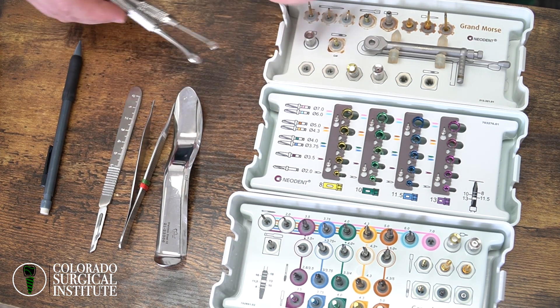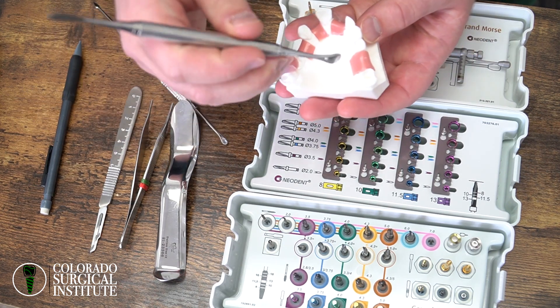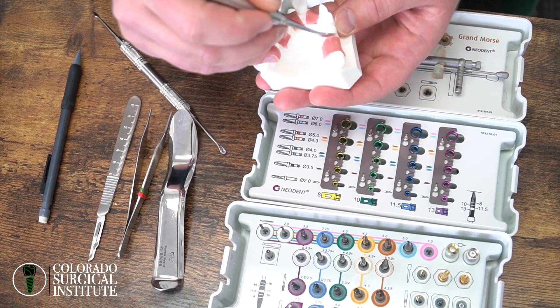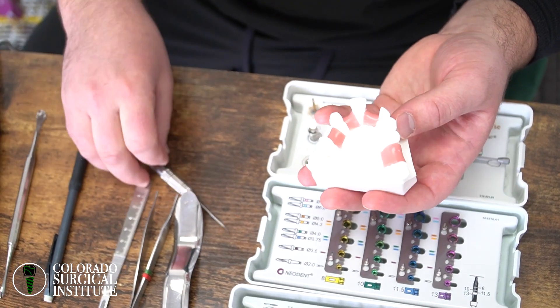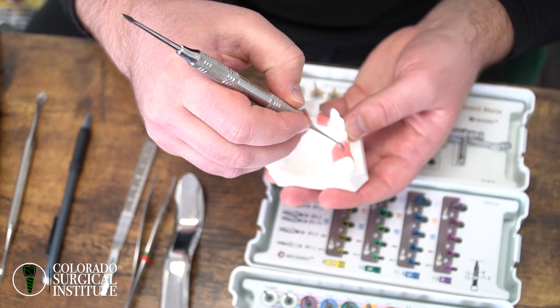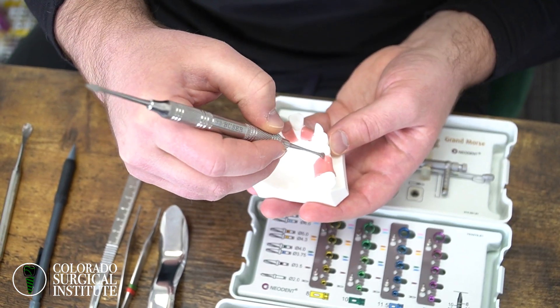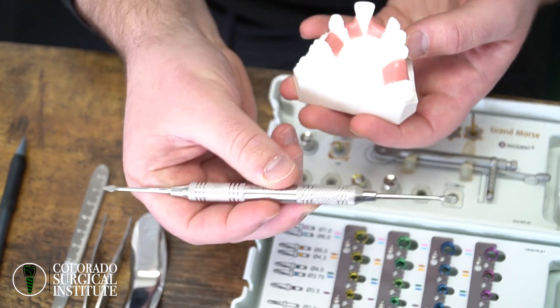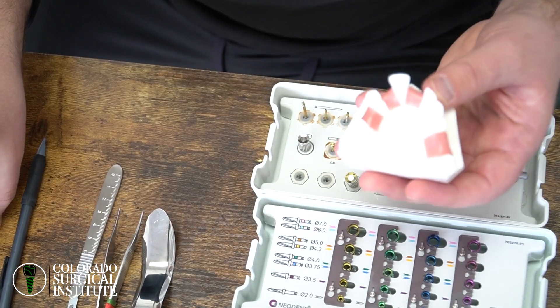If you go in with the larger instrument, it's pretty fat — at that point you're kind of mashing the tissue, making almost pulled pork out of it, as opposed to using something smaller and sharper to start reflecting your incision. So definitely use sharper and better instrumentation.